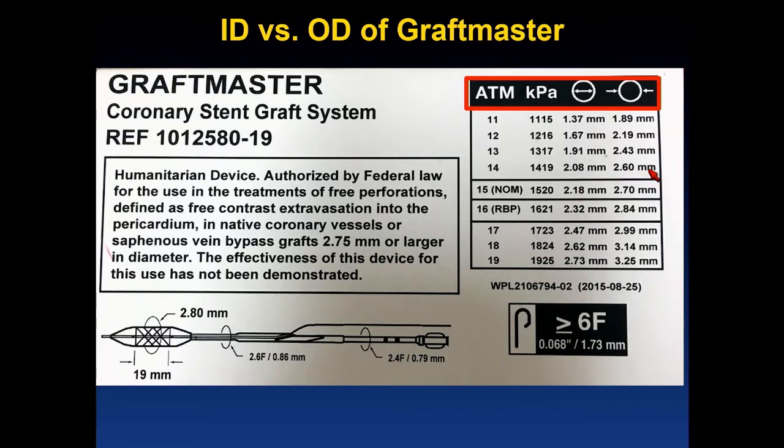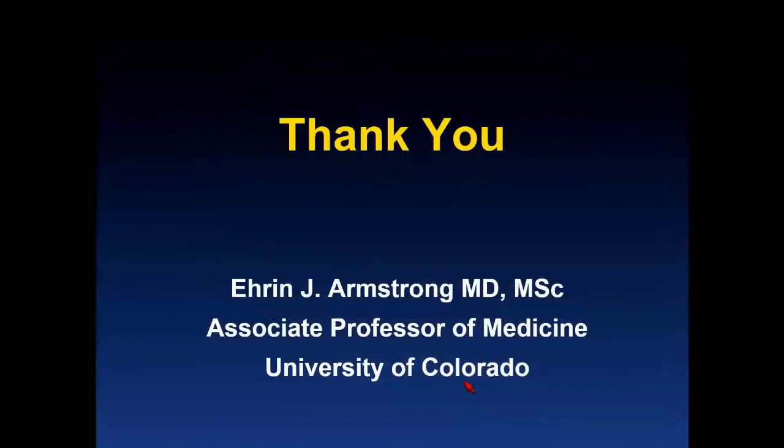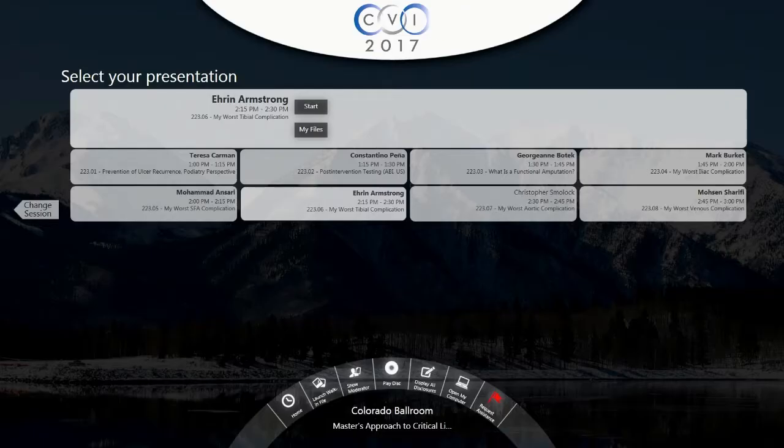I also find this hard to believe, but somehow the nominal pressure is 15 and the rated burst pressure is 16, I guess suggesting that you should be careful when you inflate them. So thank you very much. Ehrin, that was fantastic.